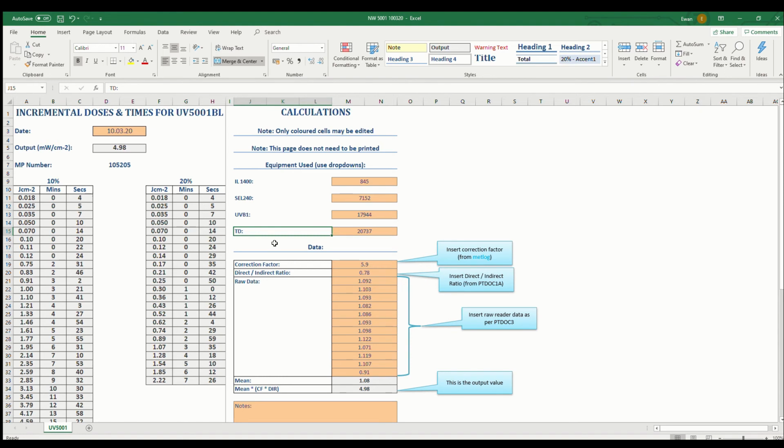The spreadsheet's for indirect measurement, and I've already described the indirect technique that we use, the 12 measurements with the detector and the clamp stand. So that's these values you can see I've highlighted here, and the resulting mean.